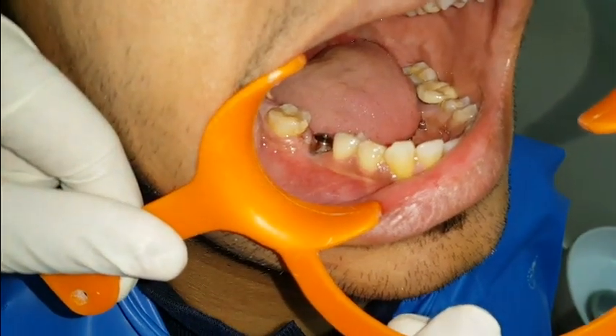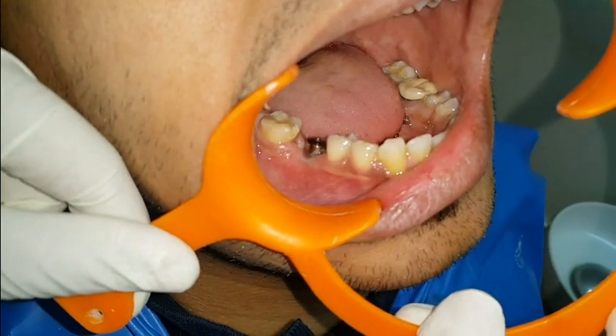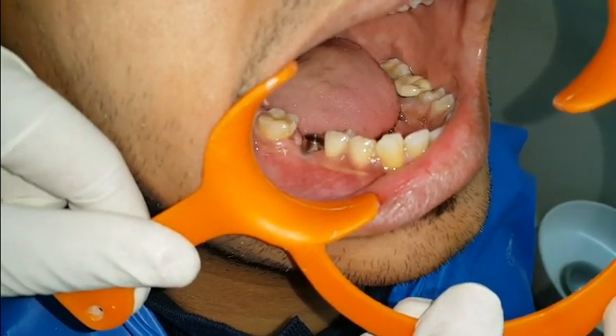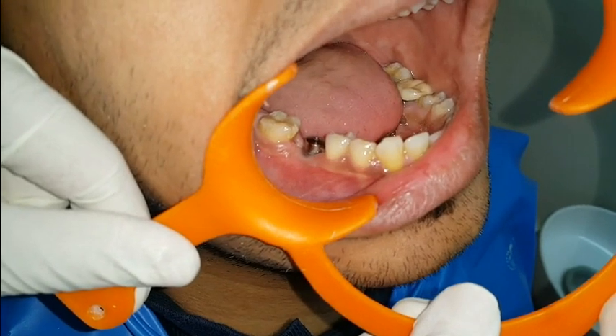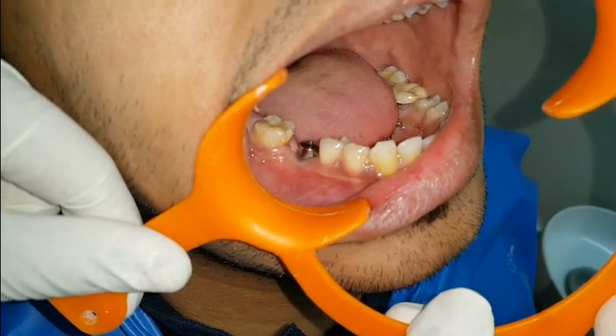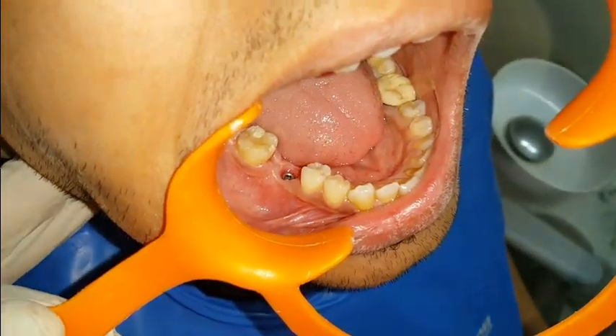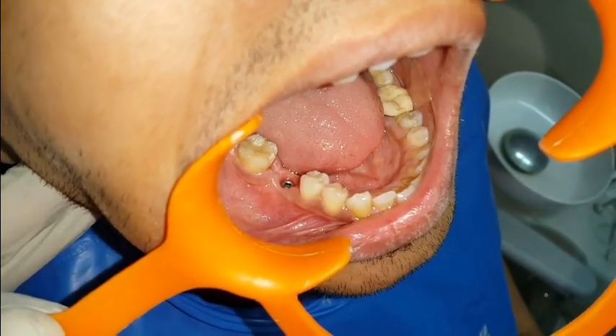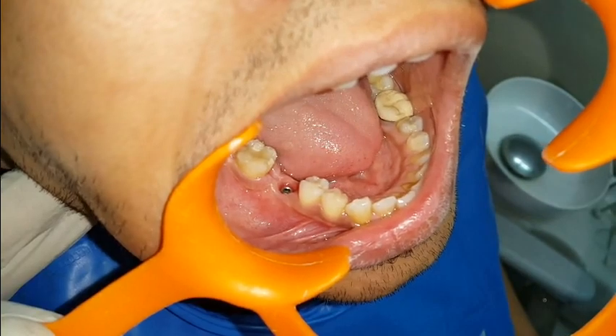This is the clinical situation where you can see a gingival former placed at the position of mandibular right first molar region. It was placed three weeks back. You can see now the gingival former is removed and there is a nice gingival collar formed around the implant.